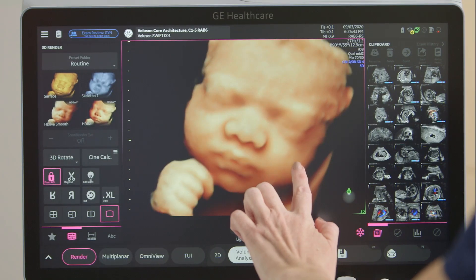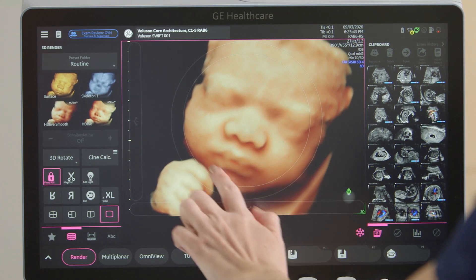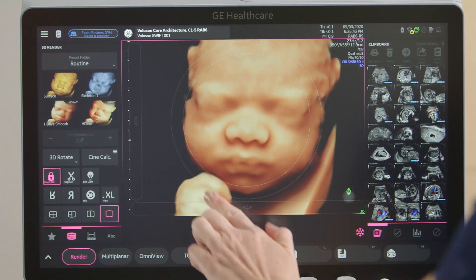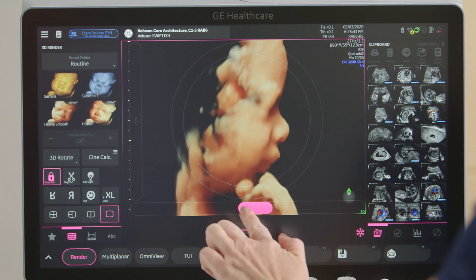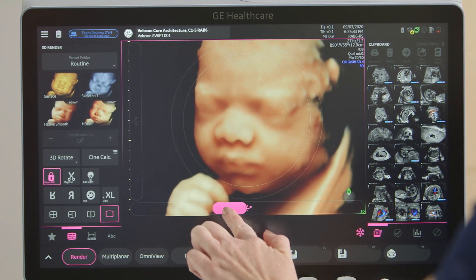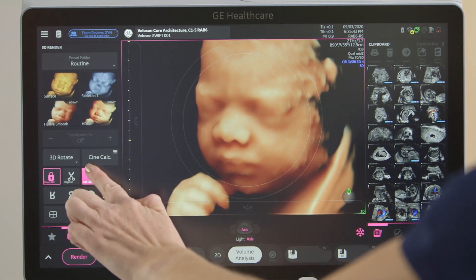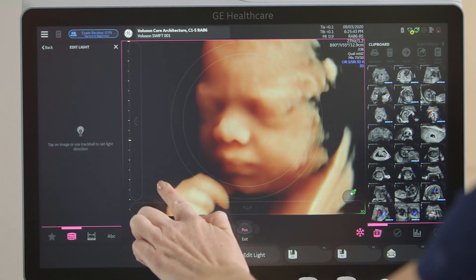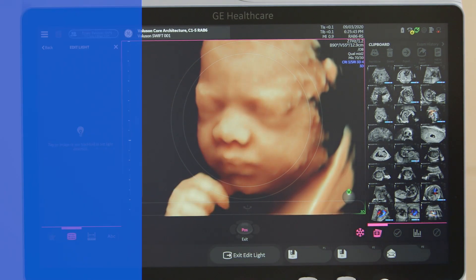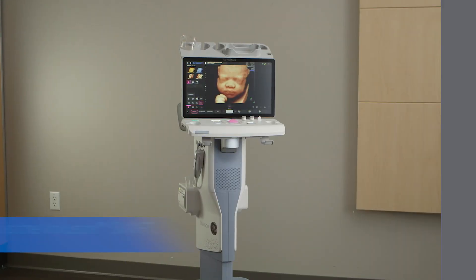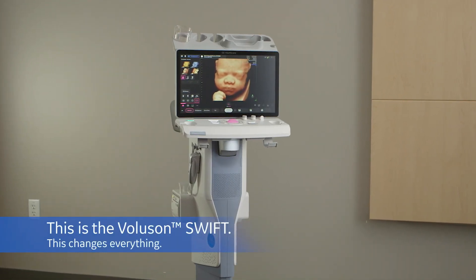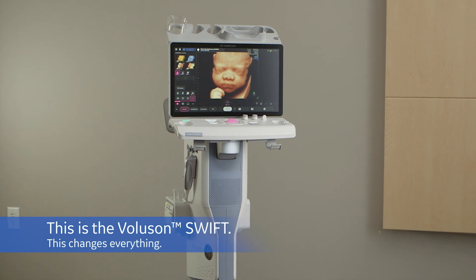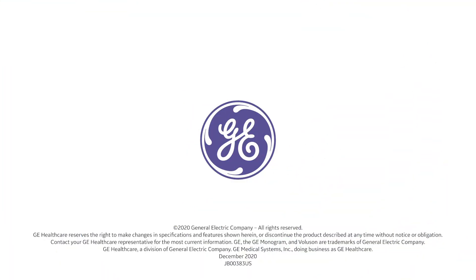In addition to 2D imaging controls, 3D/4D imaging controls provide quick access to commonly used volume manipulation tools. This is the Volusone Swift, and this changes everything. Thank you.